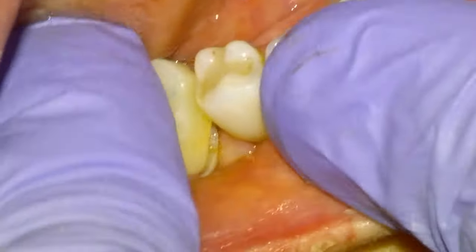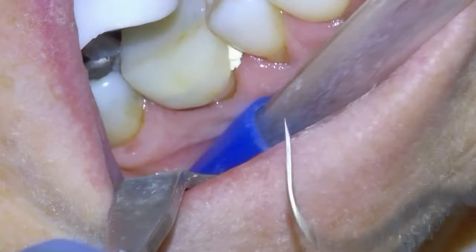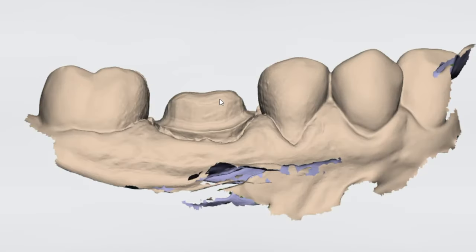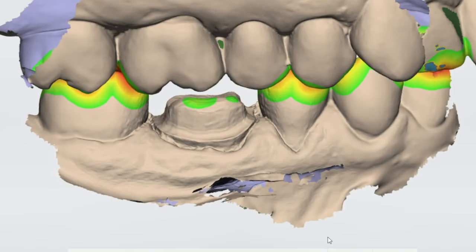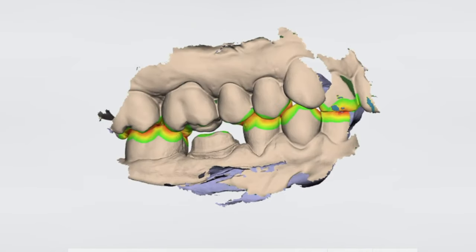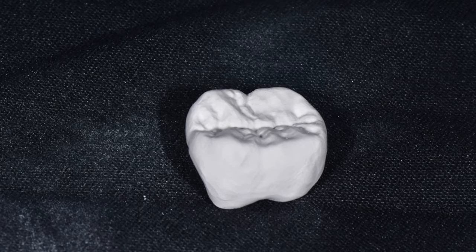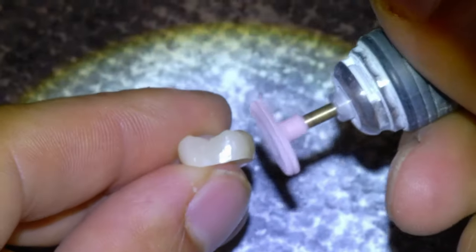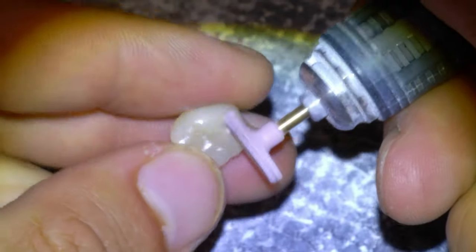I'm going to show some of the manufacturing of the crown since I make these in office. I'll send a scan to my designer — here's the scan — and he sends me back the design within a couple of days, then I'll just put it in the mill. If I need something immediately we can do next day, but I typically just do next week. There's the green-state crown after it comes out of the milling machine, and then the sintered and polished product. I have a Roland 52D dry mill five-axis that I really like.